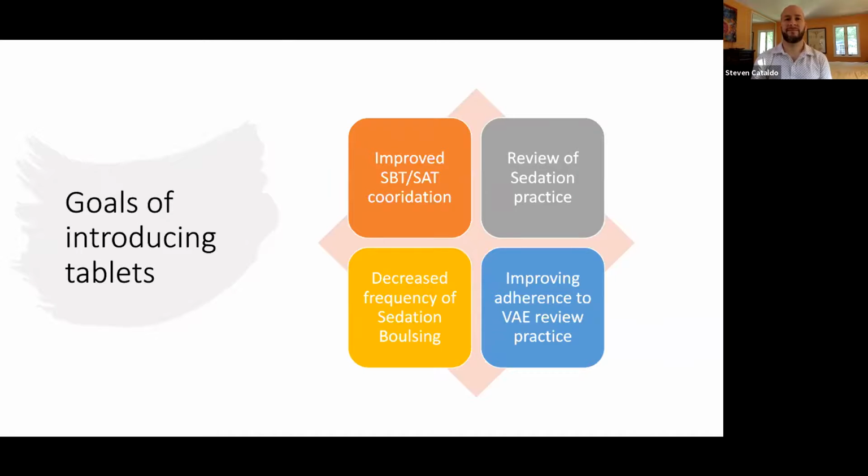And we quickly saw sedation bolusing decrease. And it was one of those findings that we're putting patients on spontaneous awakening trials and saying, well, we're doing this for every patient, yet the number of our patients are not breathing. And we would look at the number of boluses they were getting. So a patient would get 3 boluses of medication and then a spontaneous awakening trial. But the patient had so much medication aboard, they weren't going to wake up. And then they would stay in that steady state, which made it easier for some care to happen.